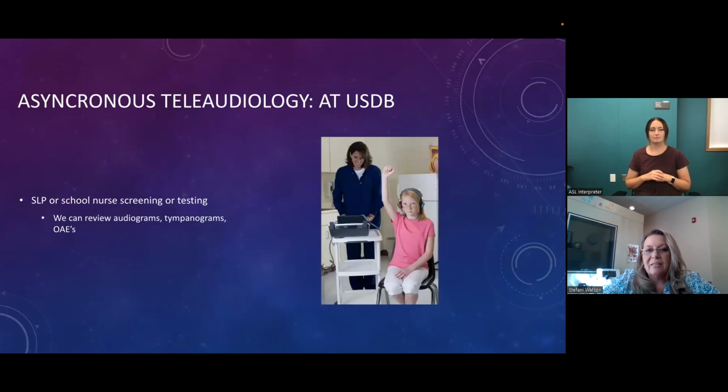The only type of asynchronous teleaudiology we do is school screenings. They can send us a picture of the information they've got as far as tympanograms, OAEs, audiograms, and then we look at them and tell them what we think is going on. Okay, next.